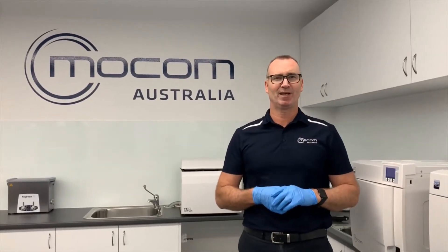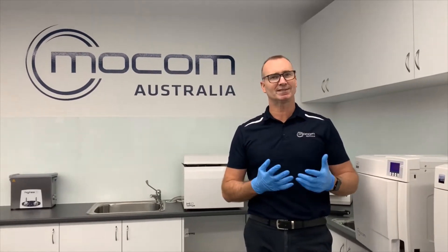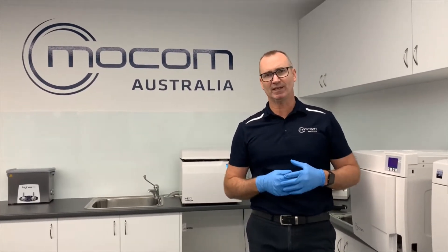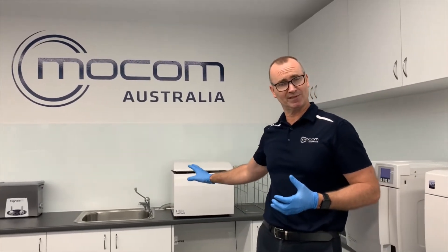Hello again from Mocom Australia. The next phase that we need to all get ready for is to reinstate the equipment. So how do we get the sterilizers and the under or on bench washers ready for service again?